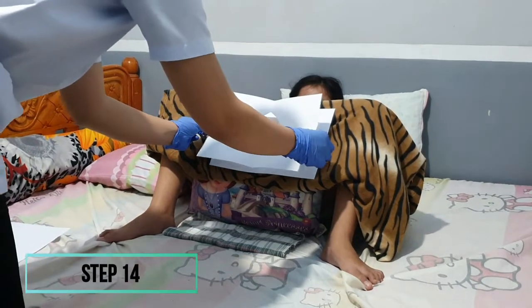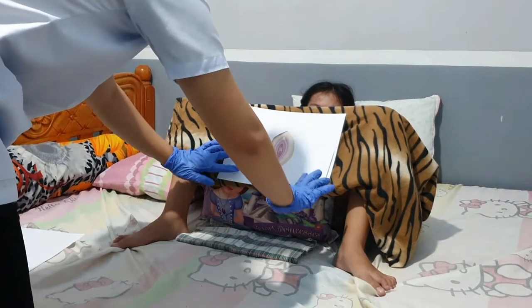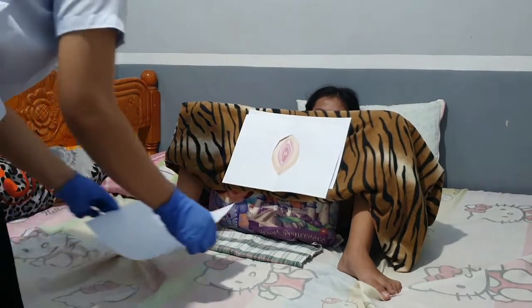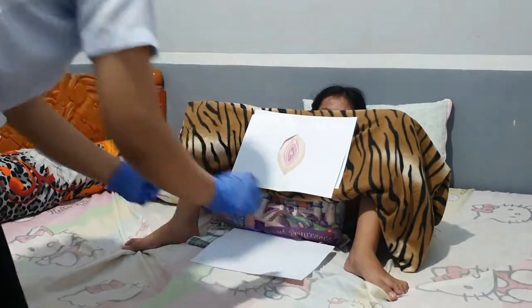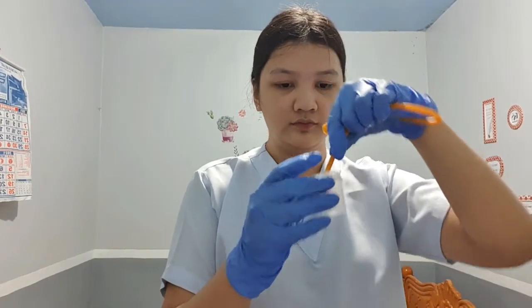If you are using an indwelling catheter with closed drainage system, attach the urinary bag to the bed and make sure that the clamp is closed. Perform hand hygiene. Next, we need to apply sterile gloves using sterile technique. Drape the patient with the drape found in the catheterization kit to expose the perineum. Lubricate the tip of the catheter using the sterile lubricant included in the tray. Then check balloon inflation using a sterile syringe.